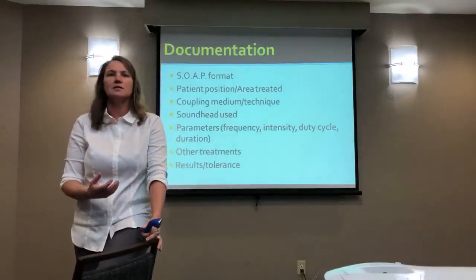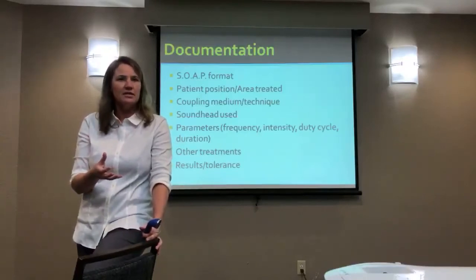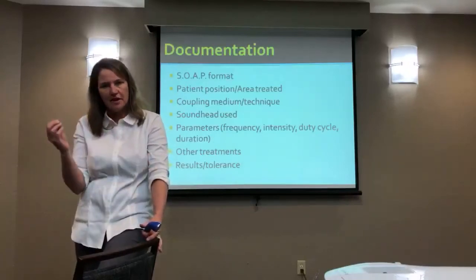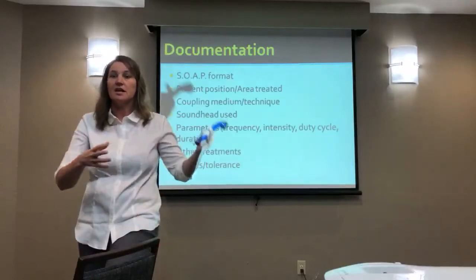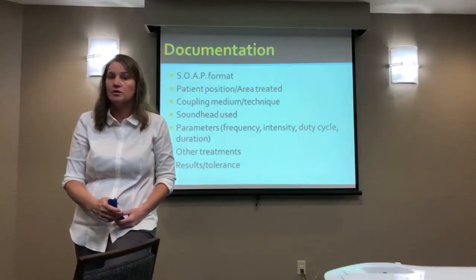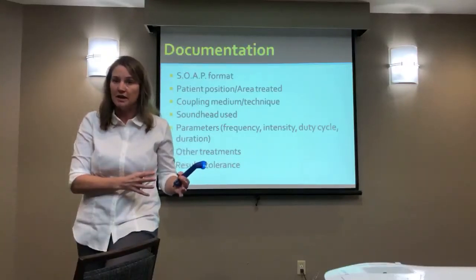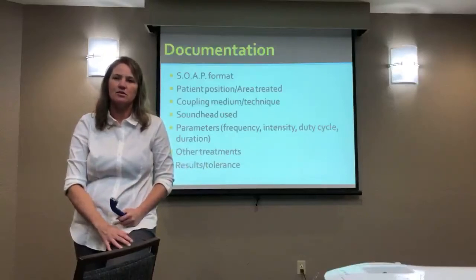But then someone who has Parkinson's or hemiplegia, or high tone, is there anything out there that says I can't keep doing this? Why couldn't I? If I'm maintaining their range of motion, or coming in and seeing them from time to time, we use the same modality to achieve what we achieved once before. Who's to say there's anything wrong with that? Now, I don't know whether you can get paid for it, but if you found something to be effective and then they regress again, could you not do it again? It's all a clinical judgment. It's whether it's of value still.